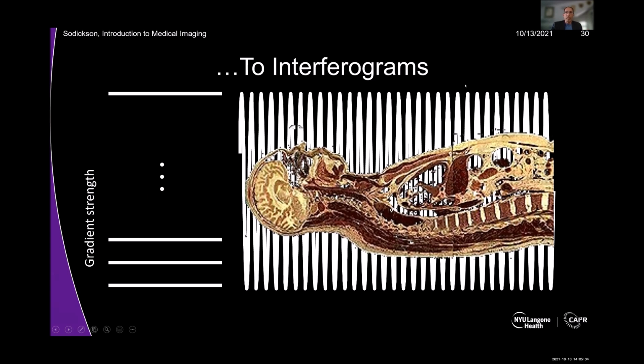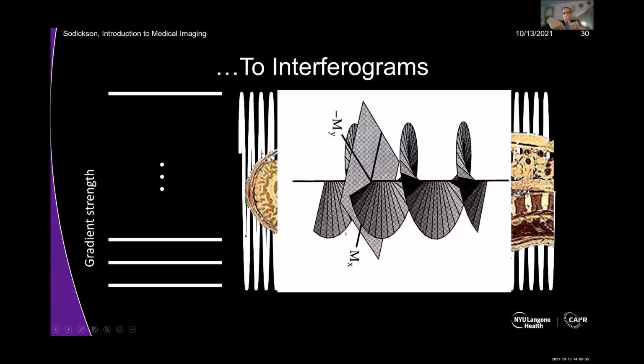Now, I'll just mention that I've just put the sinusoids here, but in fact, of course, these spins are spread out around the unit circle. So what you're getting is this sort of helix, which means we really have a complex modulation, a complex sinusoid modulation, and we need to measure the phase, as I mentioned before.